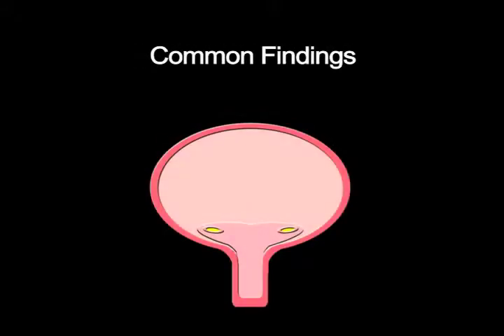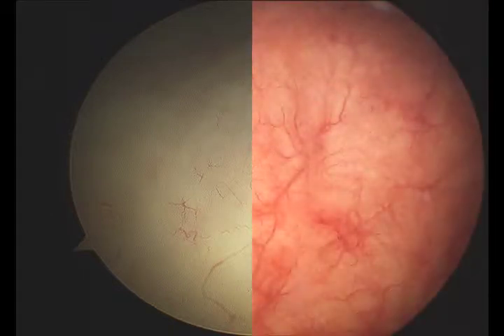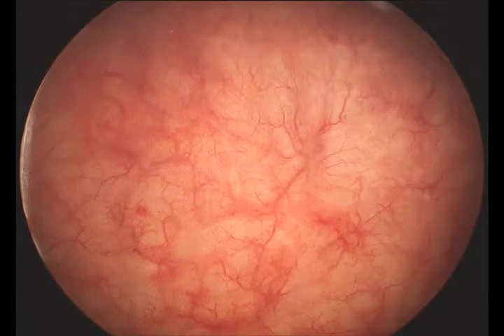Common cystoscopy findings. The appearance of the normal urothelium is somewhat pale with fine arterial and venous blood vessels. This is in stark contrast to a bladder that has hypervascularity, as shown here in this image. Hypervascularity itself demonstrates an increase in the presence of both arterial and venous blood vessels within the bladder. If the reason for such pathology is unknown, a bladder biopsy may be indicated.